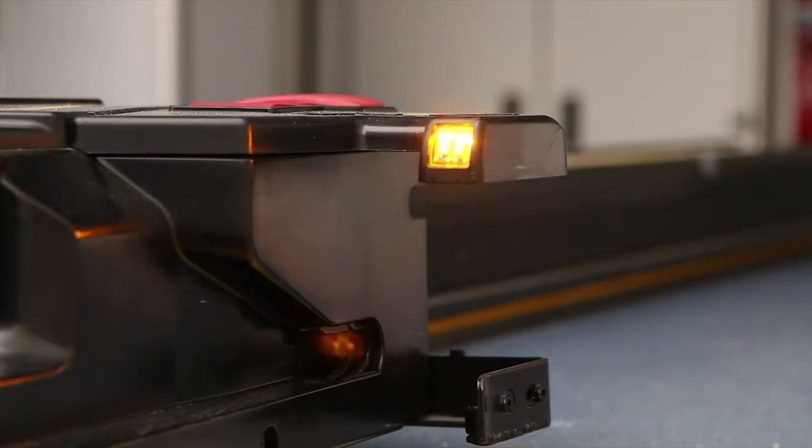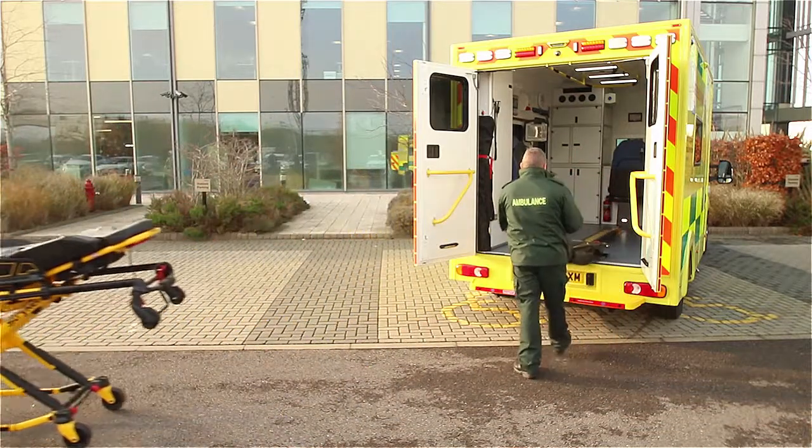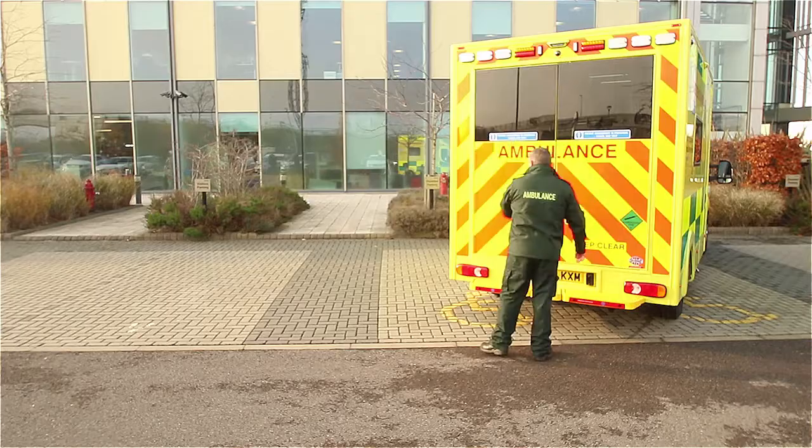The LED indicators will flash amber to indicate the stretcher has been disengaged from the PowerLoad. You can raise the lifting arms and guide the PowerLoad into the vehicle if you need to close the ambulance doors.